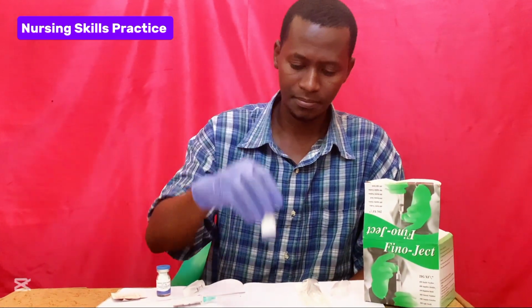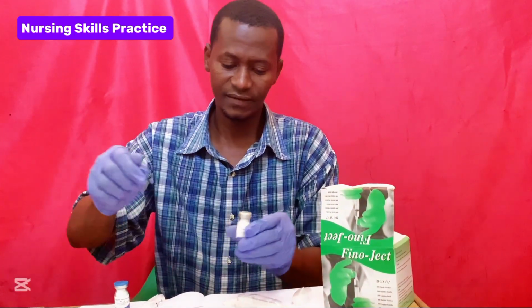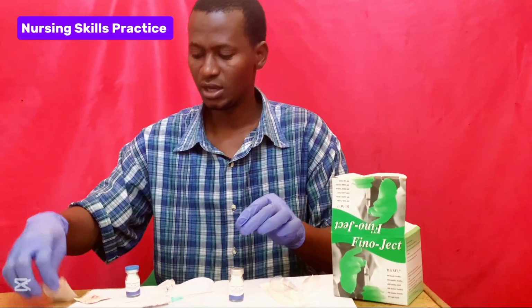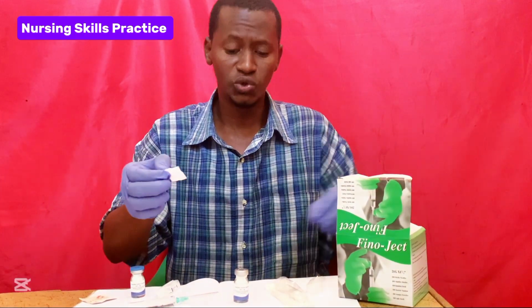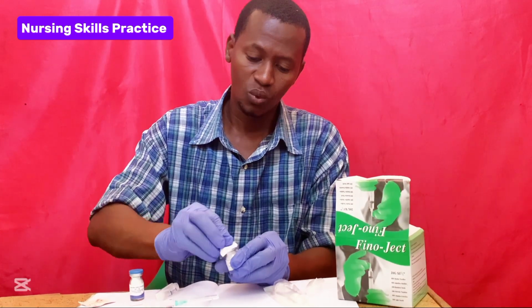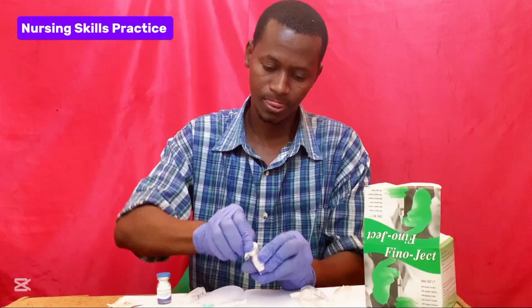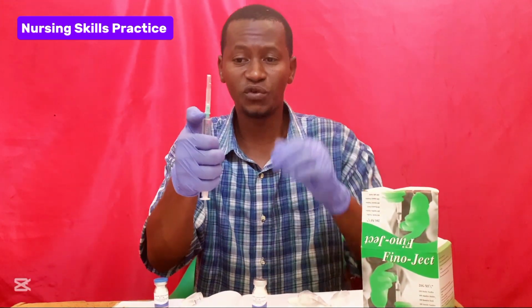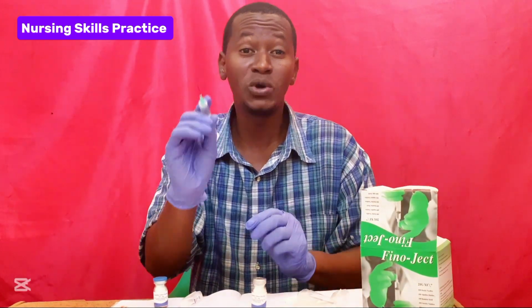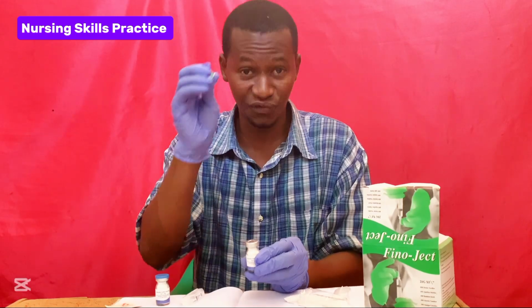Then you get the vial of 500 milligram. You open the opening of the vial. Then you get an alcohol swab. You clean the opening of the vial first with the alcohol swab. Then you get the sterile water for injection, that is 4.7 ml, to be dissolved with the 500 milligram powder for injection.